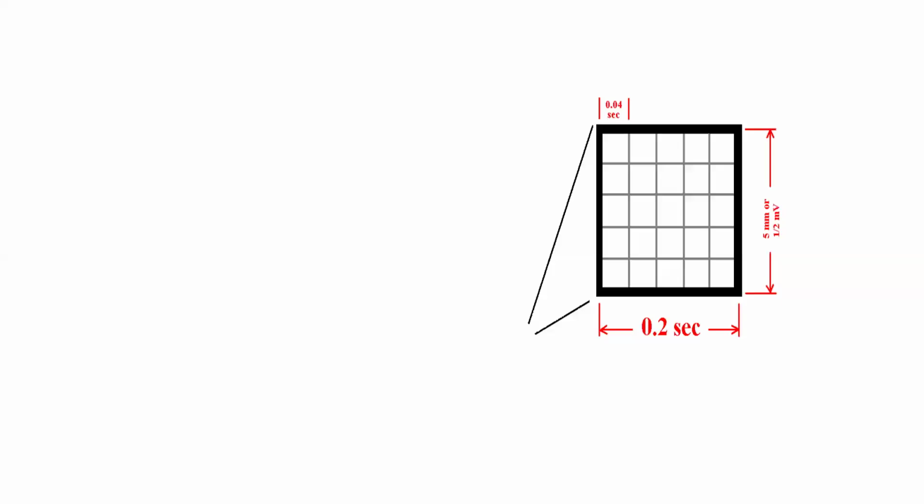Okay. So now let's delve into the ECG and how you are able to calculate the rates for your patient. Now, the common ECG machine's default speed is at 25 millimeters per second, okay? So the stylus pen, because the ECG paper is thermosensitive, once it is connected, the speed that is set is meant to be at 25 millimeters per second. 25 millimeters per second means 1 millimeter is one small box. Basically, it means that this stylus pen will move 25 small boxes in 1 second.